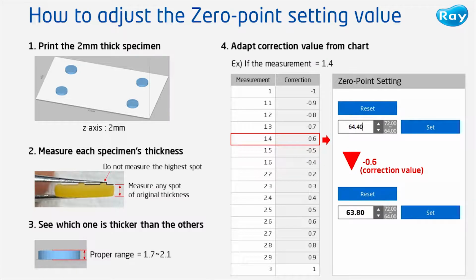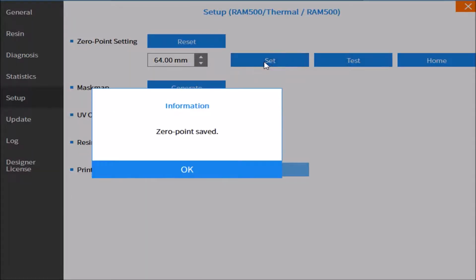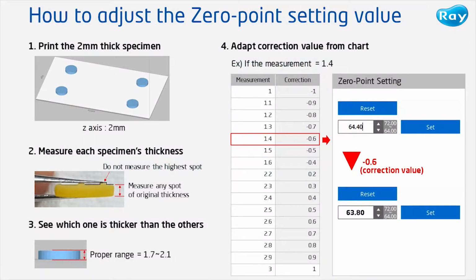In the example shown on the screen, if the thickest specimen is 1.4, the correction value will be minus 0.6. If the value of 0 point was 64.4, take away 0.6 and adjust it to 63.8 and click Set. As the 0-point setting value increases, the thickness of the printout will be thinner, and as it decreases, the thickness of the printout will be thicker.